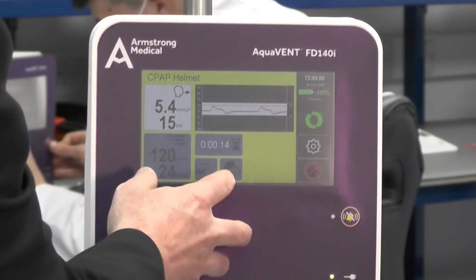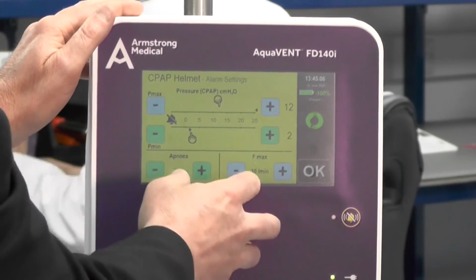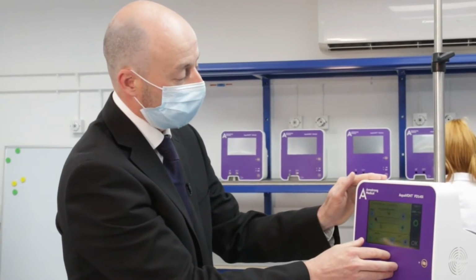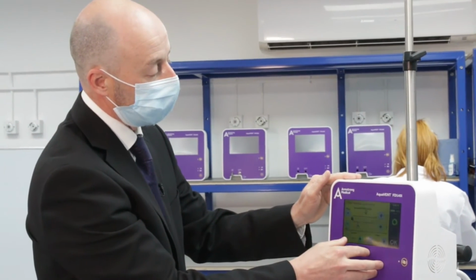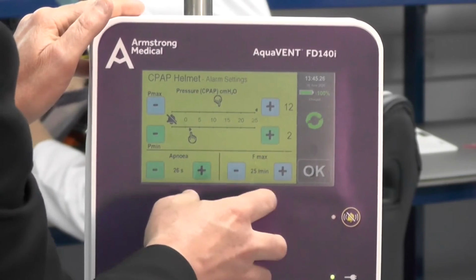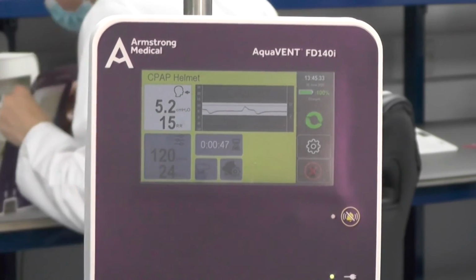At any stage, we can set the alarms. There's an alarm icon. We can go back in and set the high and low pressure alarm. We can change the Fmax. Any changes that you make, it asks you for a confirmatory action that you do want indeed the setting to change. So we change the Fmax from 30, say, down to 25. And press OK. It asks you, do you want to do that? So again, it's confirmatory, and you can make the change.